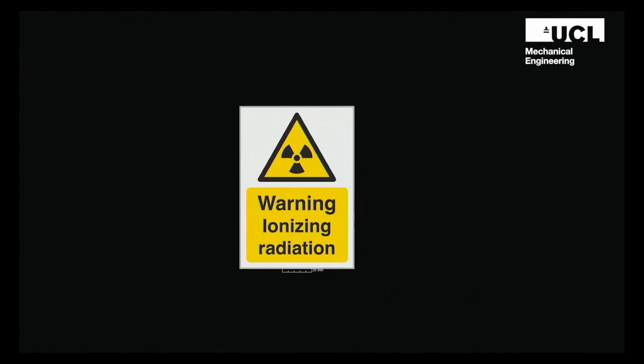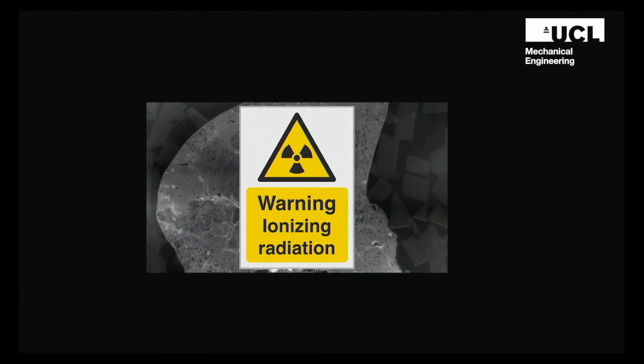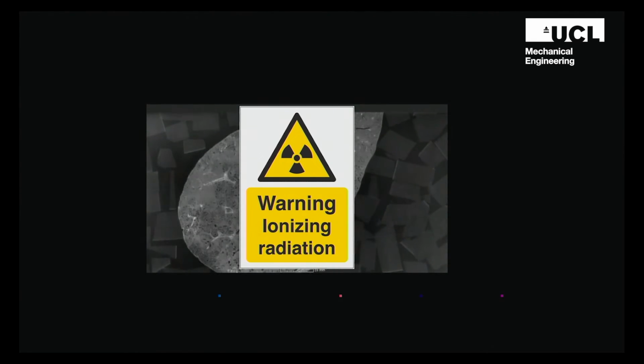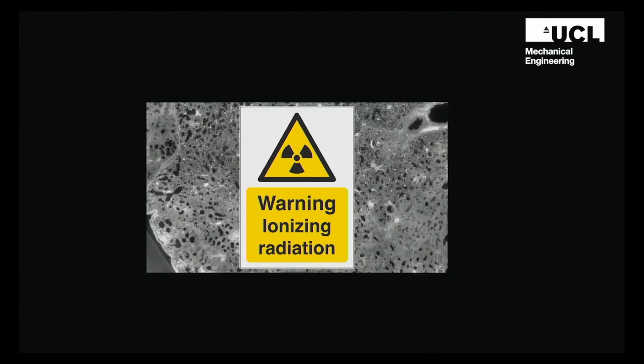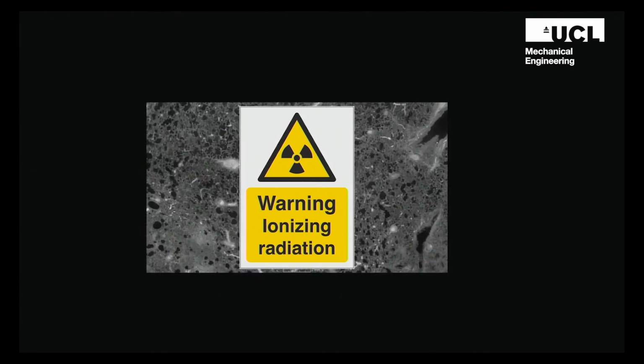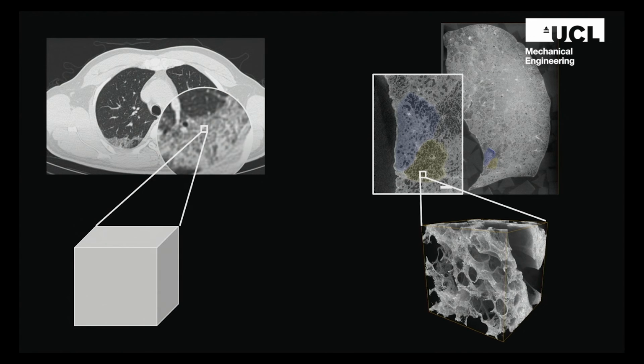However, one of the obstacles is that the X-ray dosage required to image at HiP-CT is fatal to humans. So at the moment, it gets better, it gets better. So at the moment, we are imaging whole organs of people who have died and donated their bodies to science. Now, this information is still incredibly useful, as Claire has demonstrated. But what we're trying to do now is to use this information that we've got from these organs and link them to the clinical images that we image daily in hospitals.